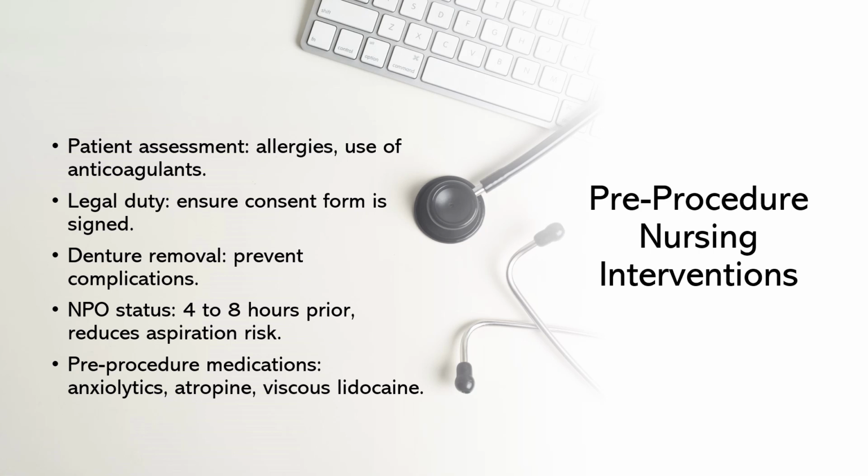We need to make sure that the consent form has been signed by the client before the procedure. Remember, you don't do the discussion that gives them informed consent. That is the provider. But you do need to make sure that consent form has been signed and they have agreed to the procedure, because that's a key part of patient rights and ethical care. Now, if the client has dentures, we need to remove them before the procedure. We do not want any unwanted complications. Food and drinks? Nope. We have to maintain the client on NPO status, usually 4 to 8 hours prior to the procedure.